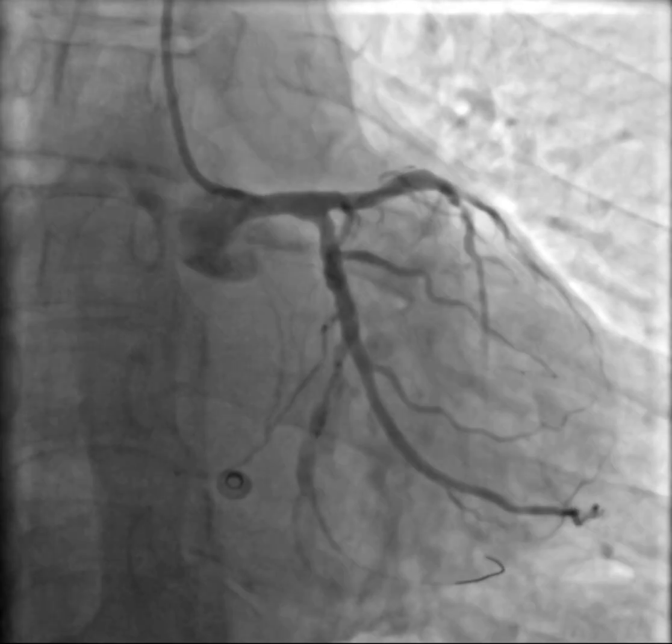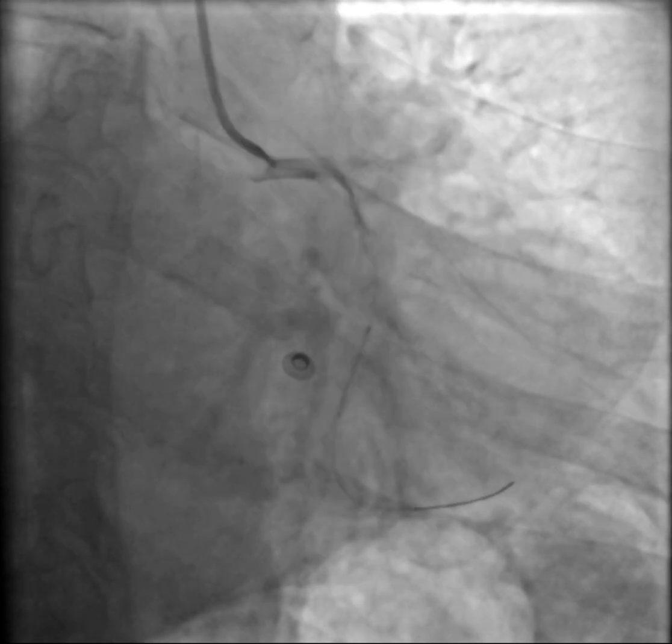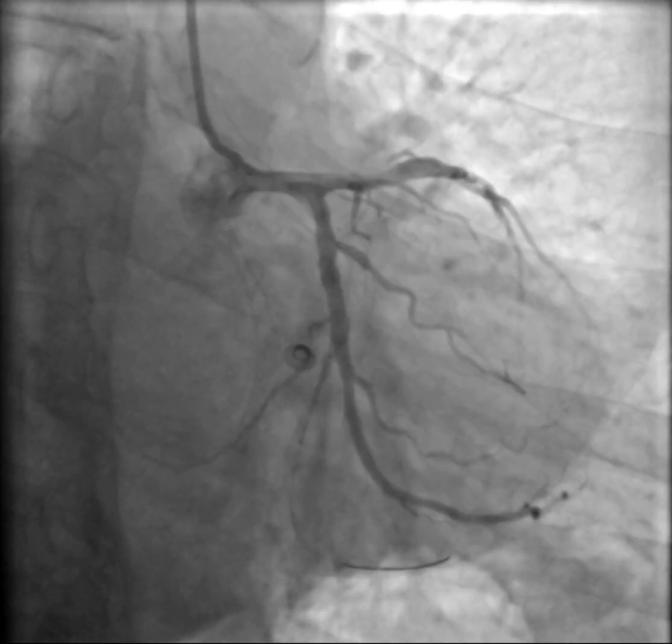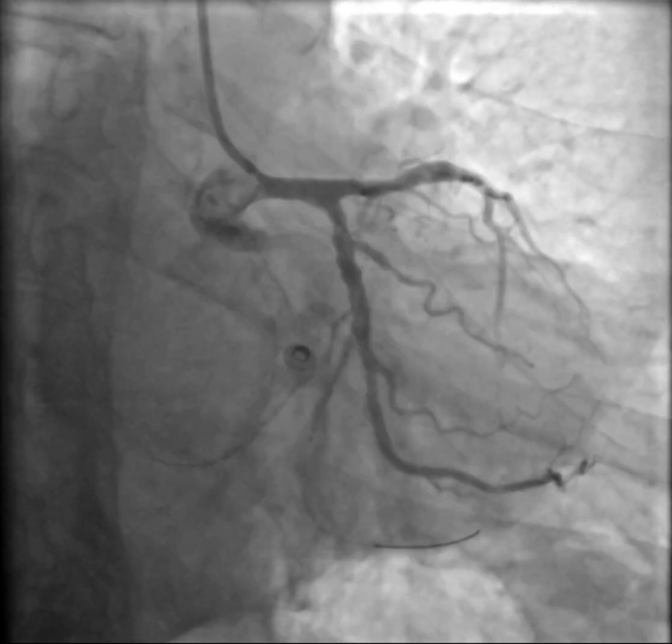We can estimate the size of the stent by the balloon size. You see. In the next step, we position a properly sized stent at the lesion site and inflate it.